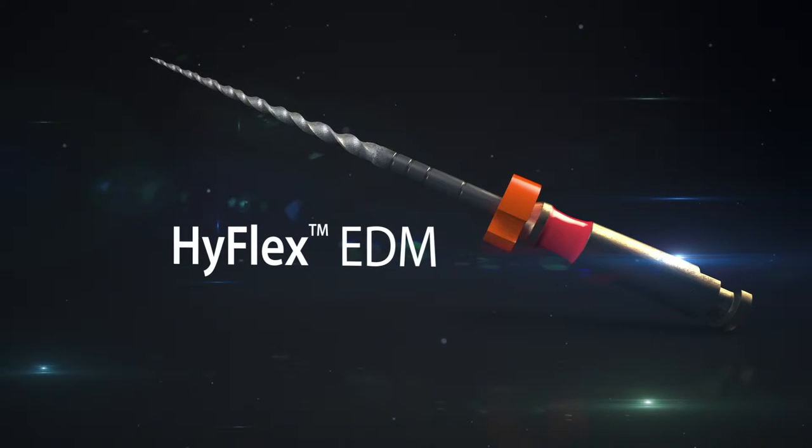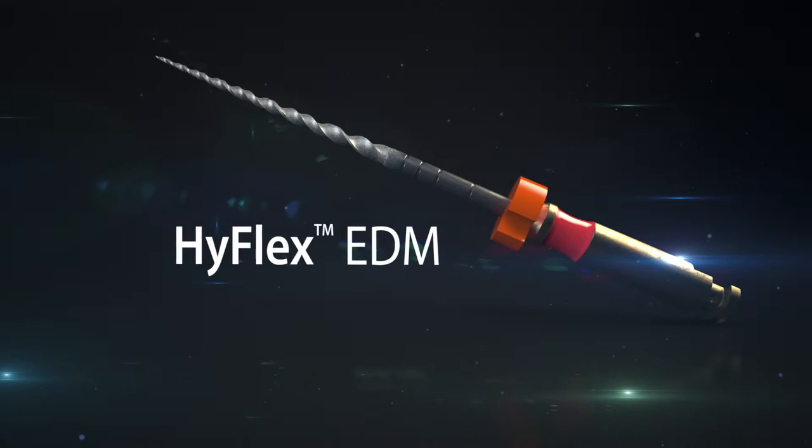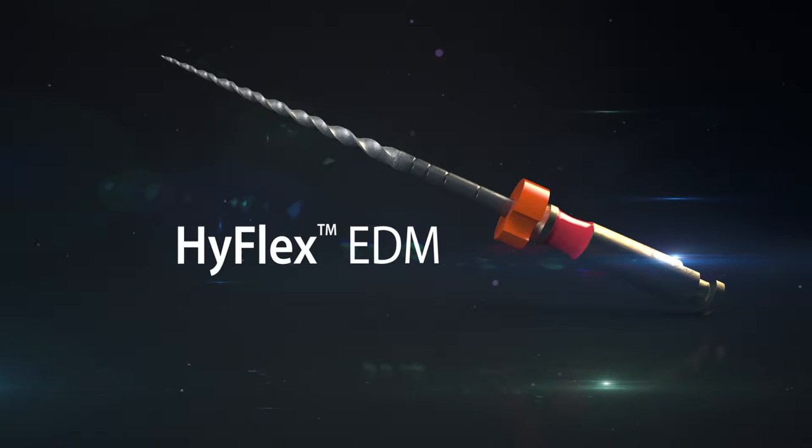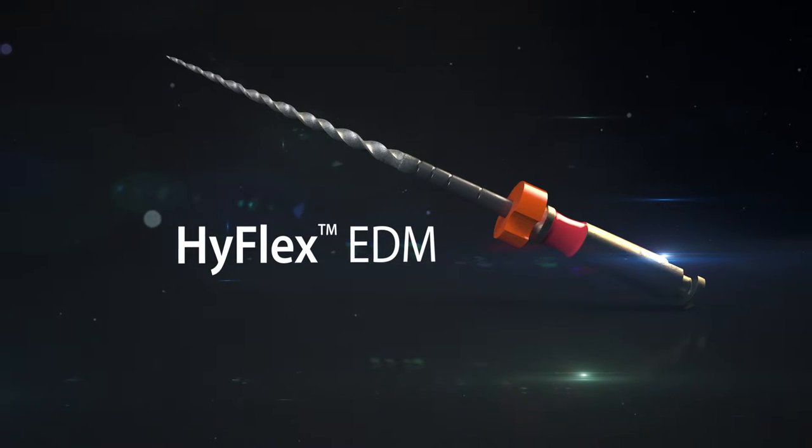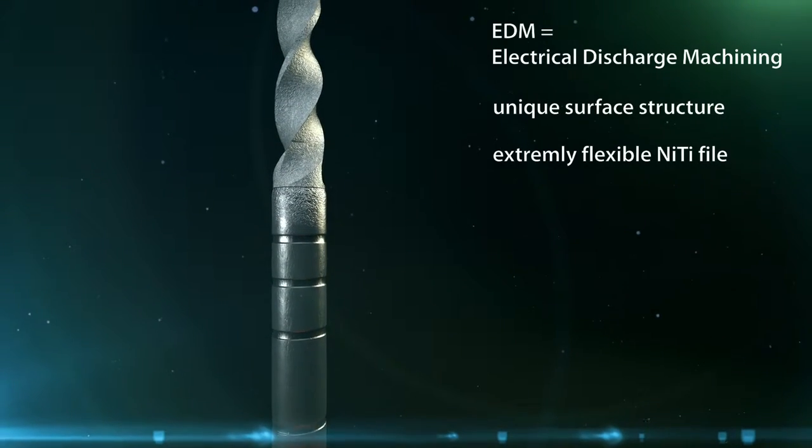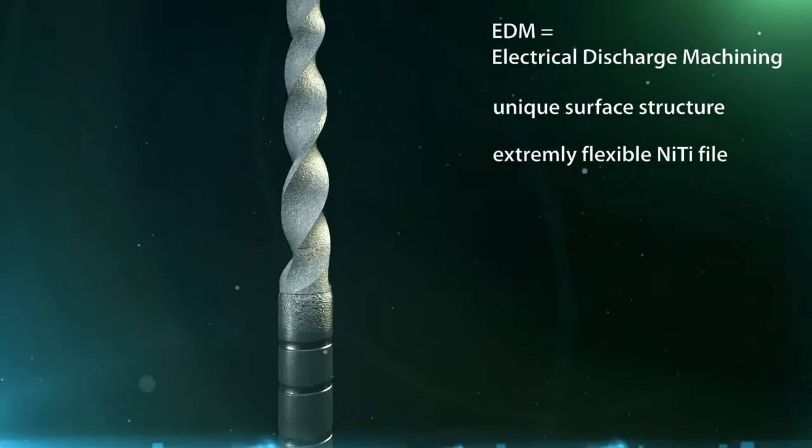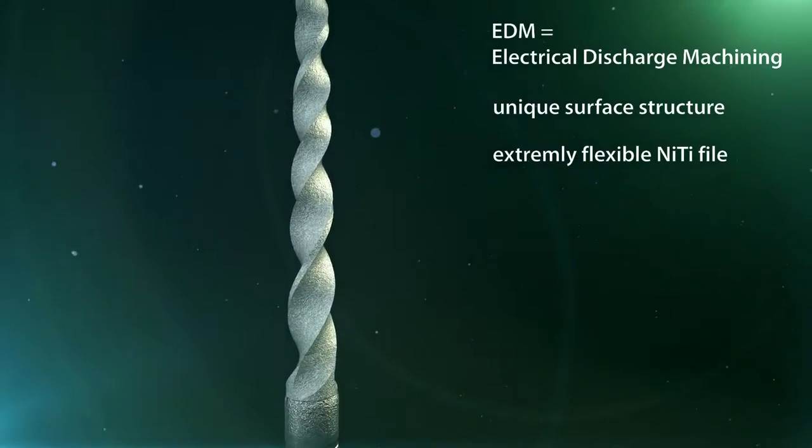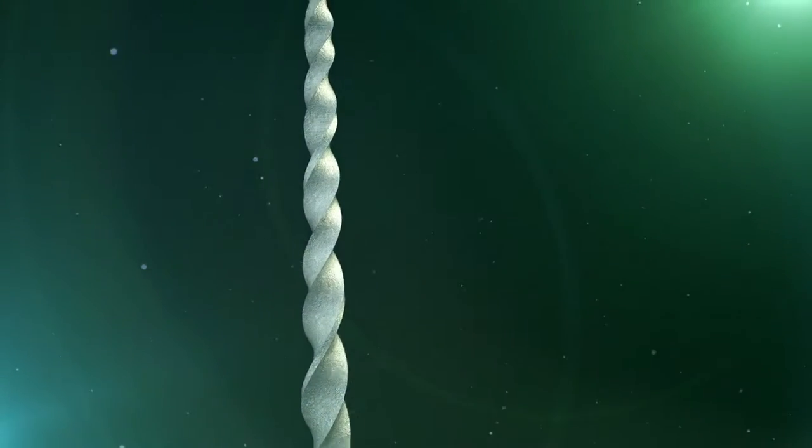Spark erosion by electrical discharge machining produces an especially efficient and extremely flexible nitinol file. The surface of the new file is hardened by the process of melting and evaporation. This produces an exceptional root canal file which is fracture resistant and flexible up to large ISO sizes.